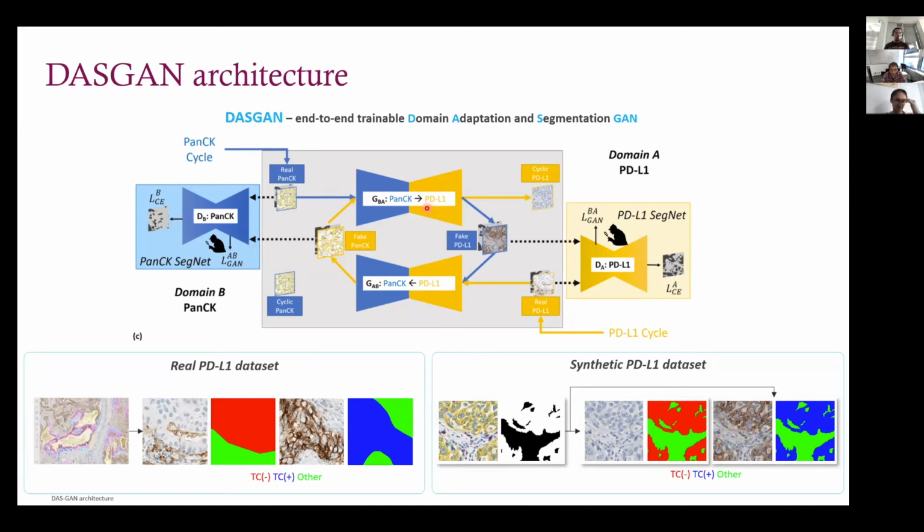And so if I got it right, you can do this without actual paired images and fit the entire cycle. Yeah, so with this network, you don't even need paired images because you're synthesizing separately. So this is one of the advantages, like I mentioned, from the previous work, where you always need paired images. In this case, you do not even need paired images.